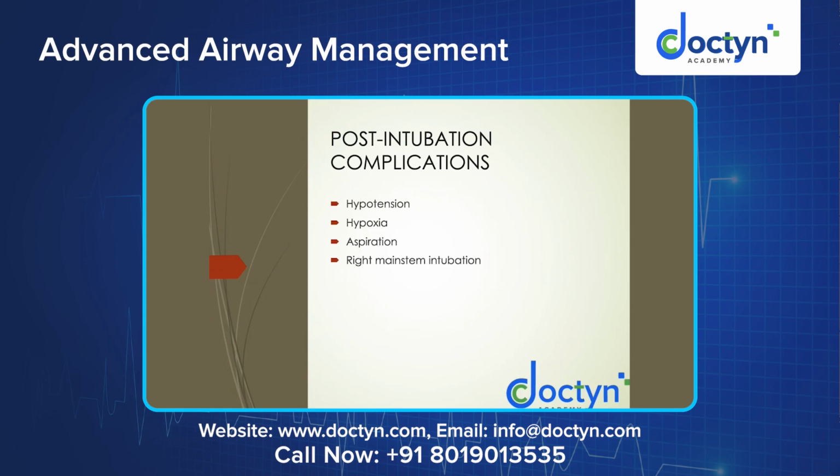There is a risk of aspiration and as I said, if it takes more time for intubation or any of the previous malpositions happen, it would lead to hypotension. There are multiple reasons why hypotension occurs after intubation. It could be due to the drugs which we have given for intubation, or the prior condition of the patient where the sympathetic system is maintaining the vitals. After we anesthetize or sedate the patient, that sympathetic drive is lost. That would lead to hypotension. There would be many reasons for hypotension after intubation. I said if the tube is too far in, that also would.